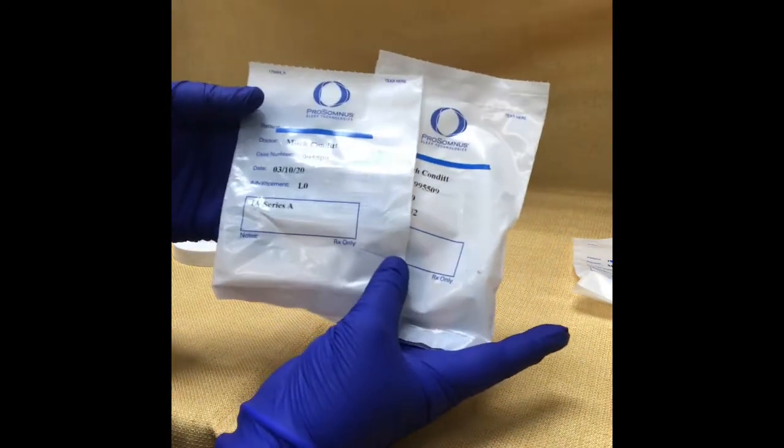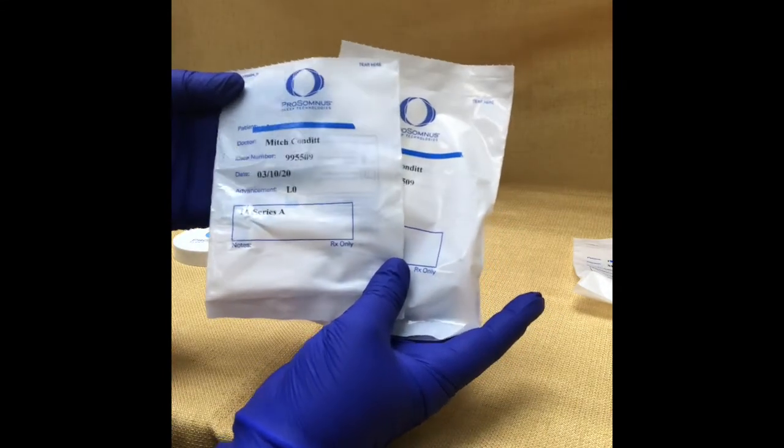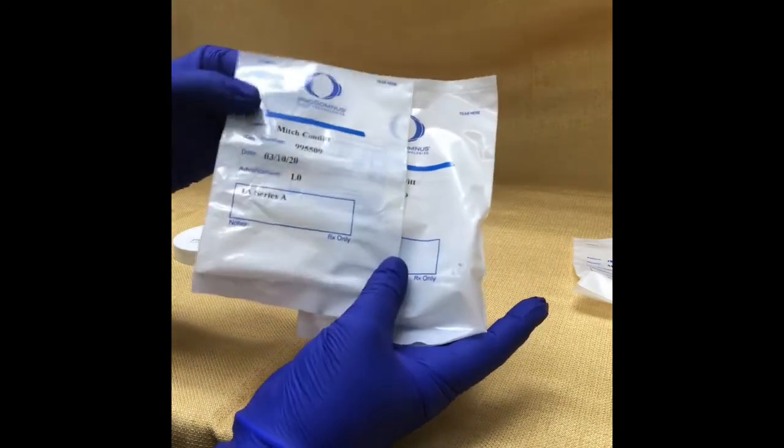Make sure after you use a set of trays, if you're changing them out, you always make sure your tray is clean and dry and then store it back in its original bag, so you don't lose track of which one's which.